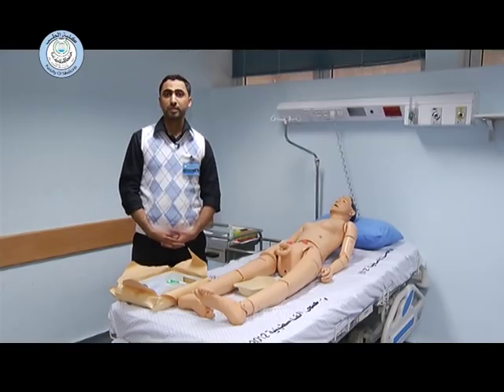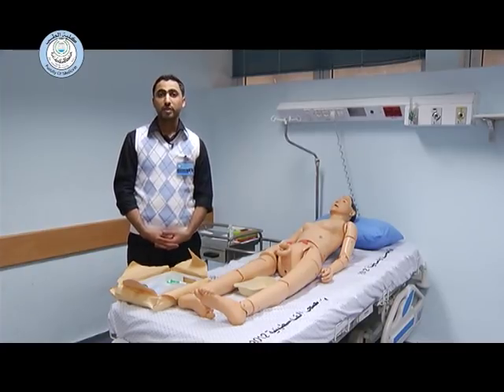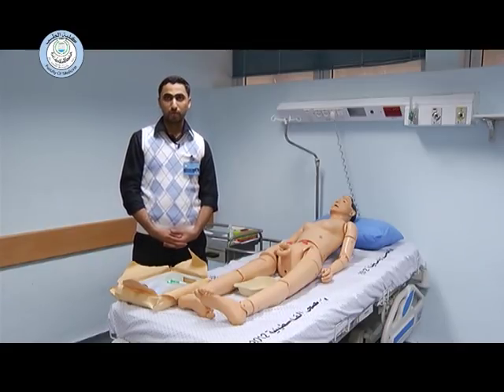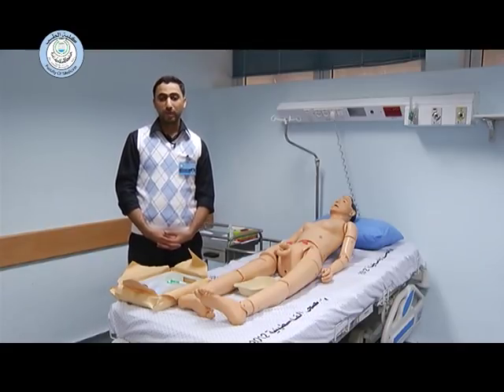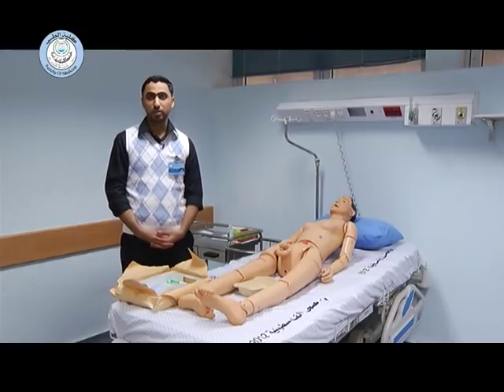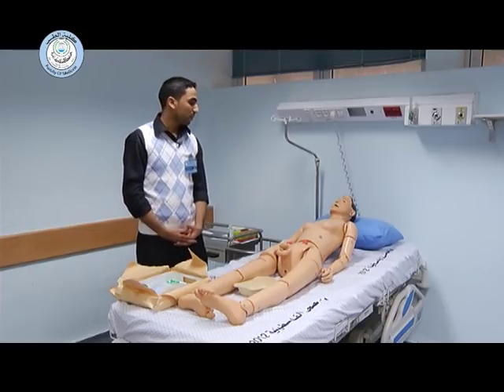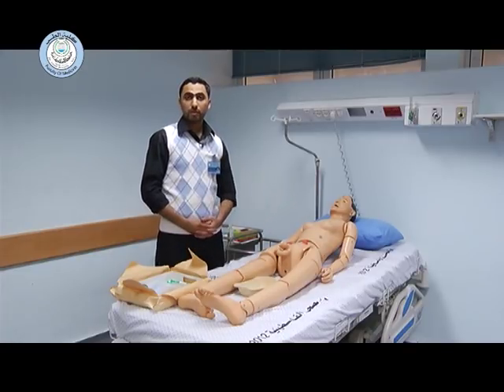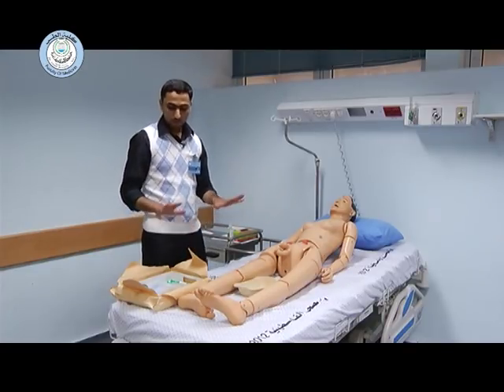Today I will demonstrate how to insert a Foley catheter. Before starting the procedure, you have to introduce yourself to the patient, make sure that the room is private, make sure that there is a chaperone in the room, and collect your instruments before undressing the patient. Explain the procedure to the patient, take his consent, and wash your hands.